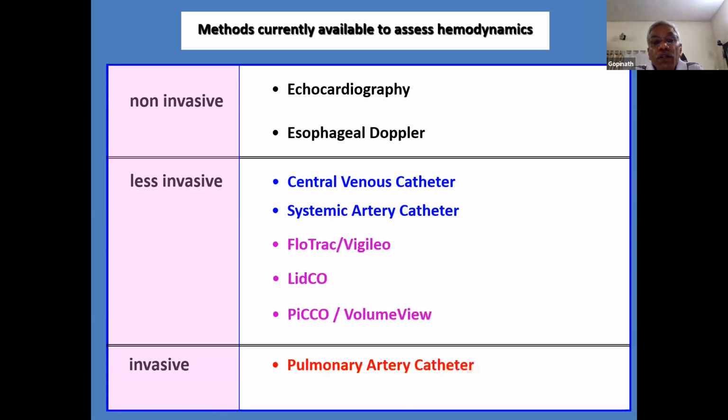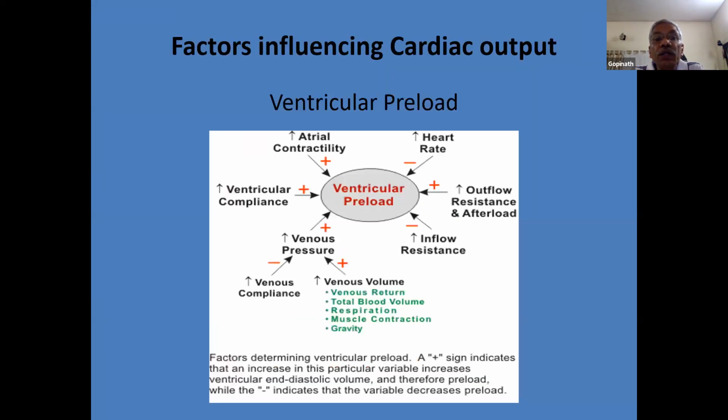If you seriously look at the non-invasive part of cardiac output, one of the very basic measures of cardiac output would be your ETCO2. Of course, it is another form of measuring cardiac output in various ways to quantify. But if you seriously look at the end-tidal carbon dioxide trace on your monitor, that strongly reflects the cardiac output, which is why when we do CPR, we always look at the end-tidal CO2 as an indicator of cardiac output, with 20 millimeters being the cutoff to assure us of reasonably good CPR or return of spontaneous circulation. So let's go to the other ones.